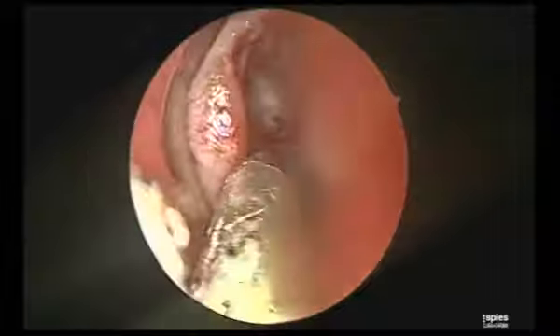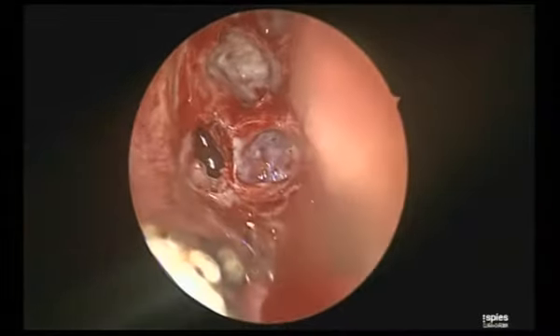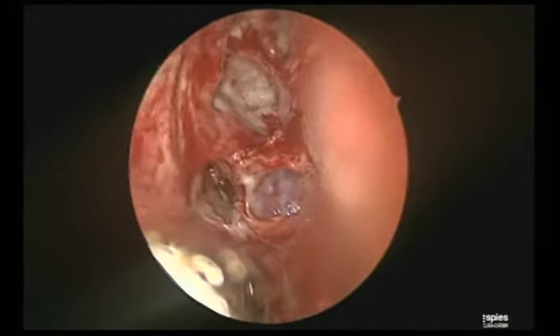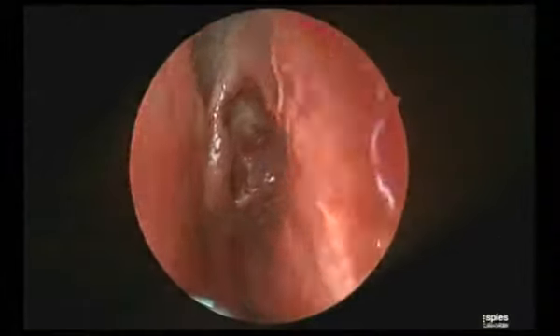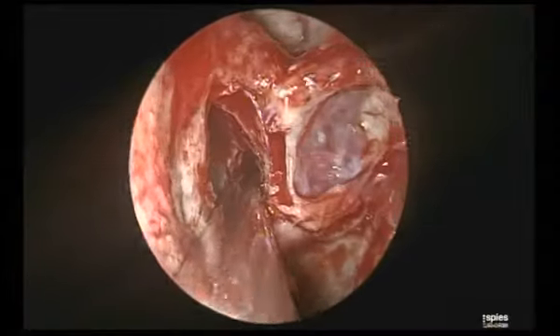So now I have a great landmark. I am tension free. I can remove my posterior ethmoids like anything, like garbage. The only thing is to preserve the mucosa. So just staying anterior to the sphenoid ostium, this is the anterior wall of the sphenoid. Now anything that is anterior to the wall of the sphenoid is very safe. So that is the posterior limit of the posterior ethmoid. So anything anterior, the optic cannot be there.